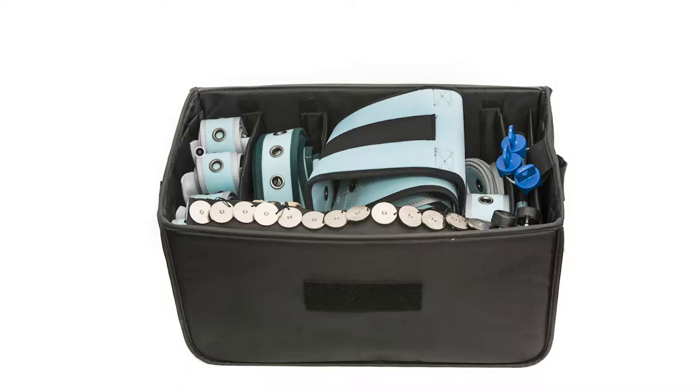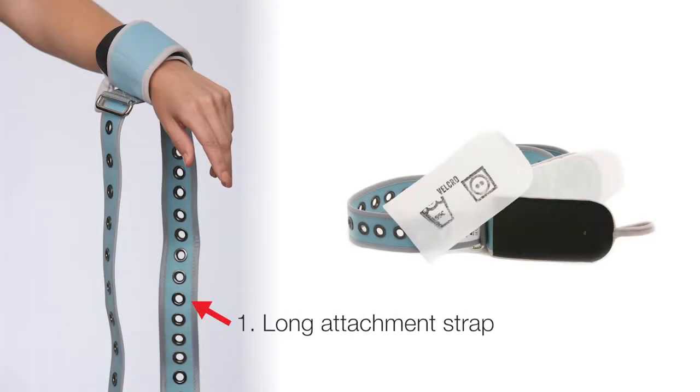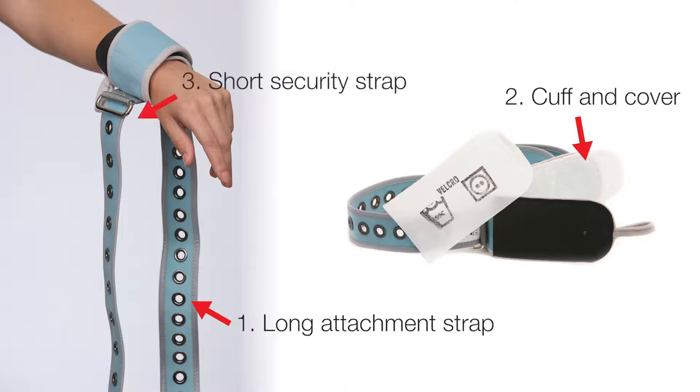The left pocket contains four universally sized limb straps for both wrists and ankles. There are three major features of the limb belt. First, the longer end contains many grommet holes for optional attachment points. Second, the cuff wraps around the patient. Third, the smaller overlapping security strap permits additional cuff support.